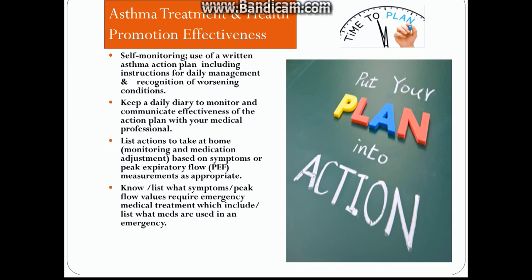You need to know that if you're having a true asthma episode, you take the before-baseline normal peak flow number value, and you take the number during your attack and you compare them. If there is a difference, you need to contact your medical doctor and let him know what your numbers are and seek help.